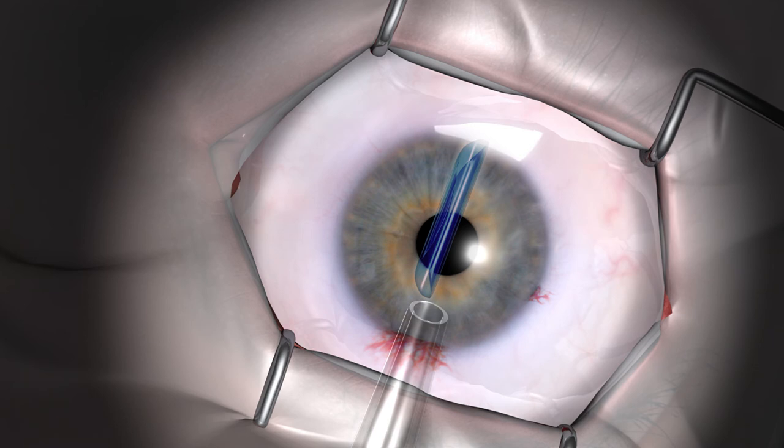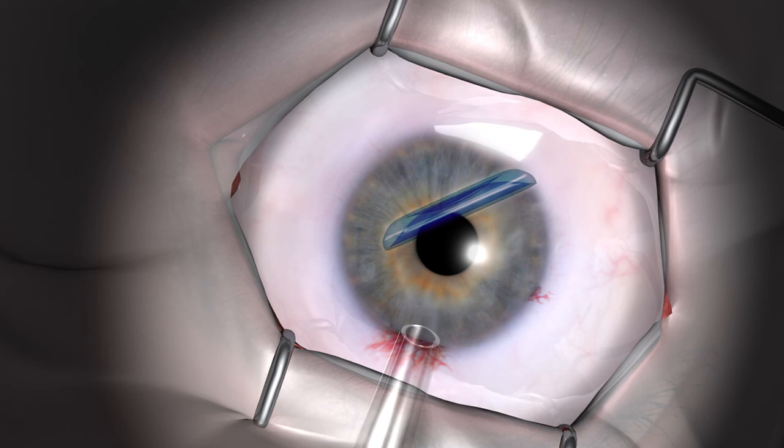Do not remove the cannula from the anterior chamber. Use bursts of fluid from the syringe to position the graft in such a way it will not follow the cannula as it is being removed from the wound.